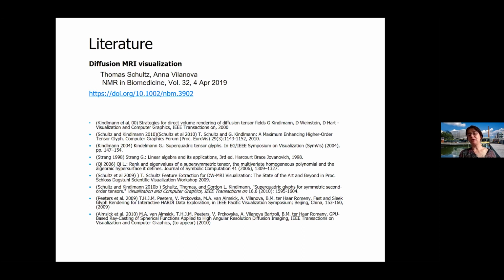In our case, we usually don't apply any more cleaning steps than this one. You have to do some corrections from the acquisition, because of the type of measurement being done, and some registrations. But once you have the signal, we don't apply any extra denoising to it for our applications.